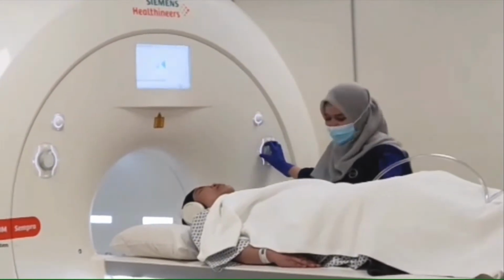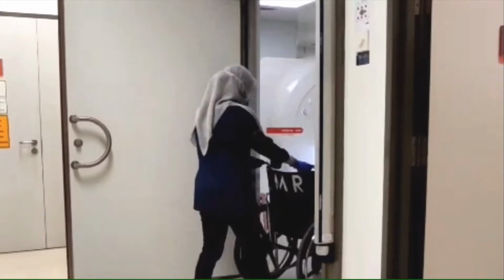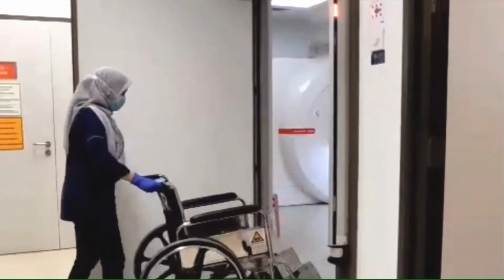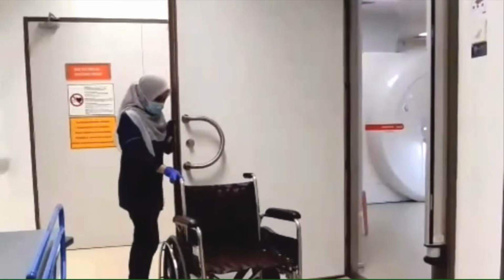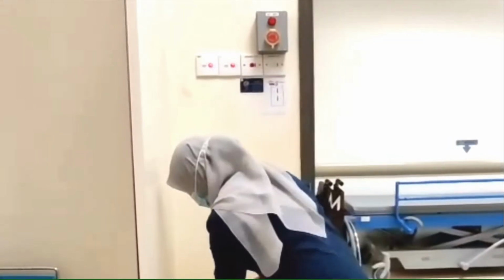Don't forget the placement of the earplug, because inside the bore itself it's very loud. So this earplug will help to reduce the sounds during the examination. You have to ensure the door is closed before proceeding to the examination.